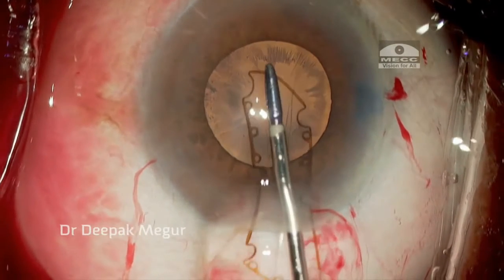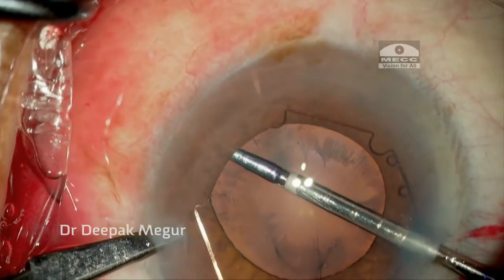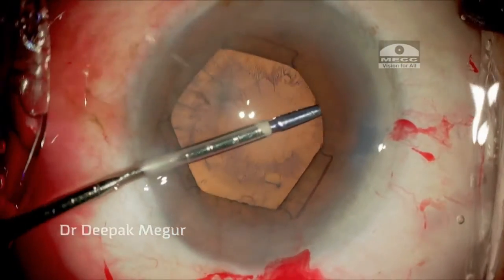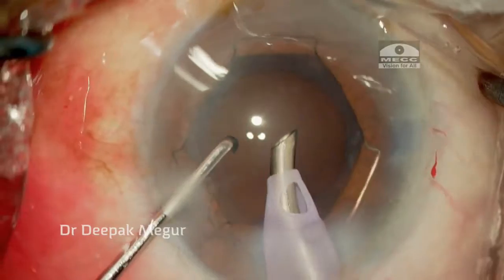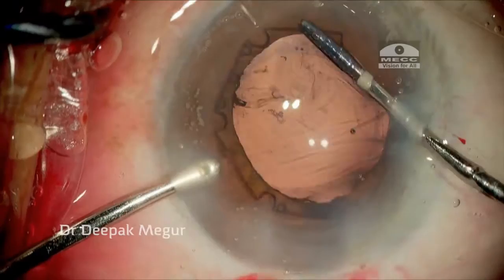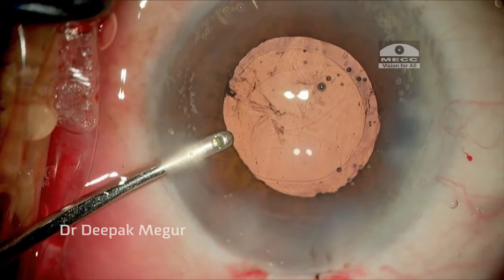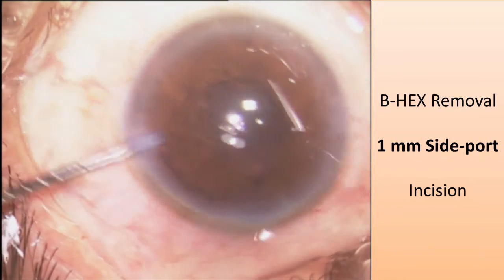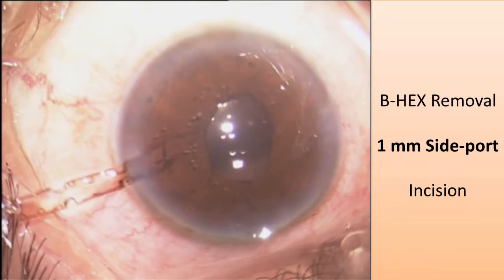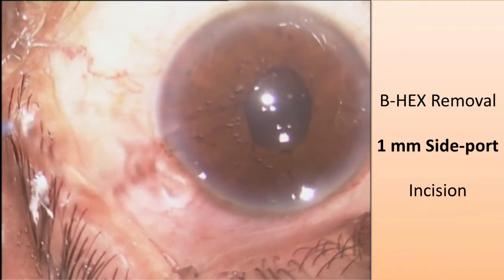This is an elastic pupil. As alternate flanges are tucked, the pupil expands to 5.5 mm for easy phacoemulsification and IOL implantation. The flanges are untucked and the BHEX literally walks out of the main incision. The BHEX is also removed easily through a 1 mm side port incision, which no other pupil expander can do, and is very useful in tight situations.